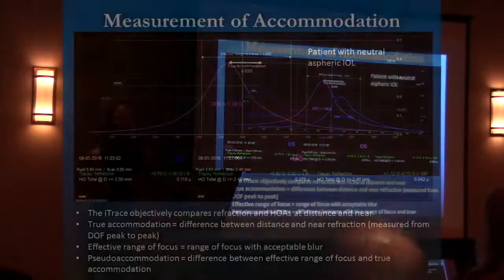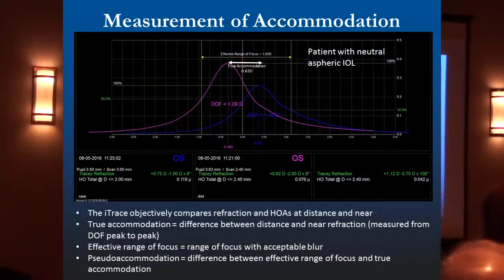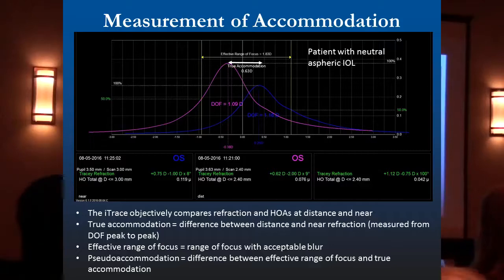So here's just to understand what we're looking at with this software. But basically, it's really easy, it's really quick. We take pictures, wavefront measurements, patients looking at a distance target and then at a near target. And what are we looking at here? Let's see if I open here. And we've been learning more and more.